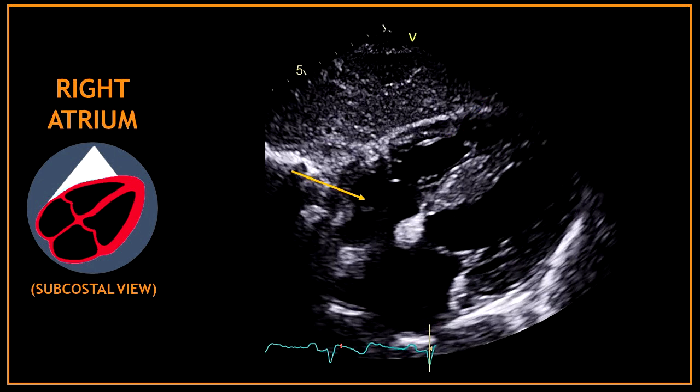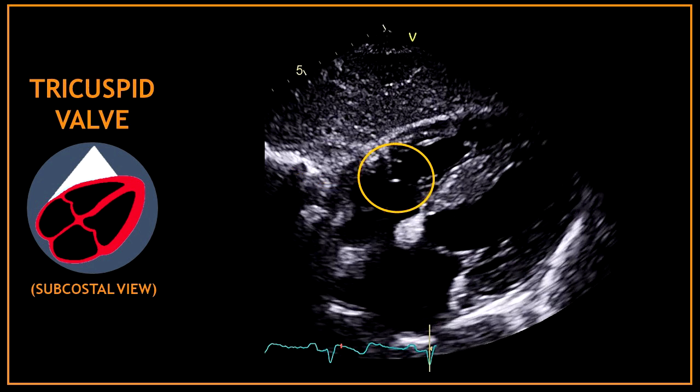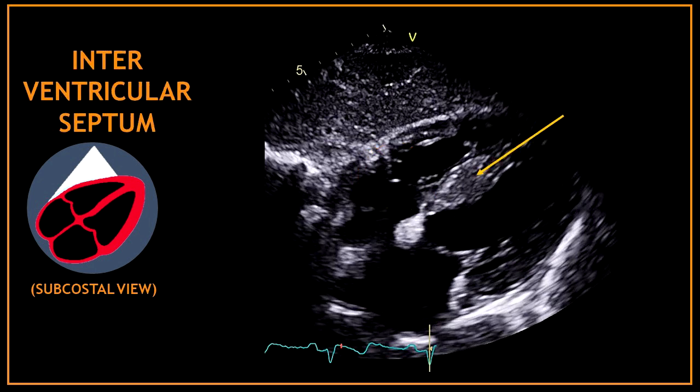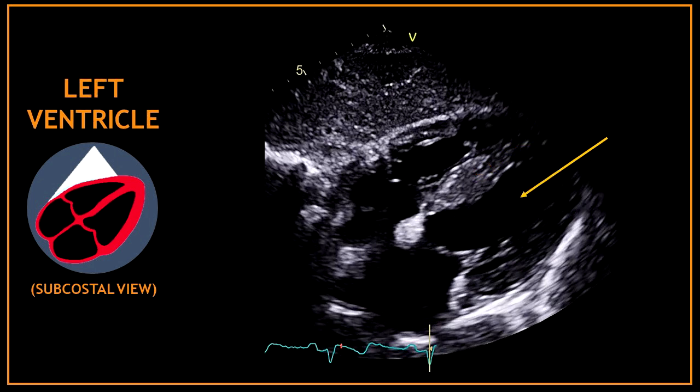More to the left, that rounded echo-free space corresponds to the right atrium. Between the right ventricle and the right atrium we can see the tricuspid valve. Between the two ventricles we have the interventricular septum. Next to the septum, that triangular echo-free space is the left ventricle.